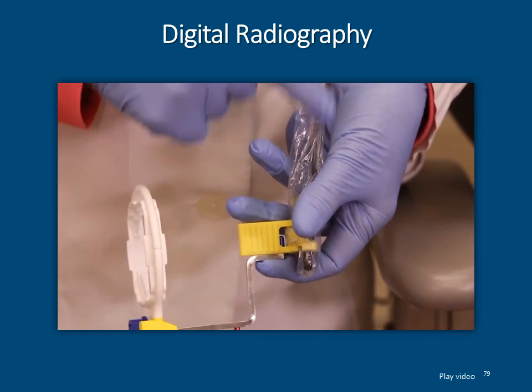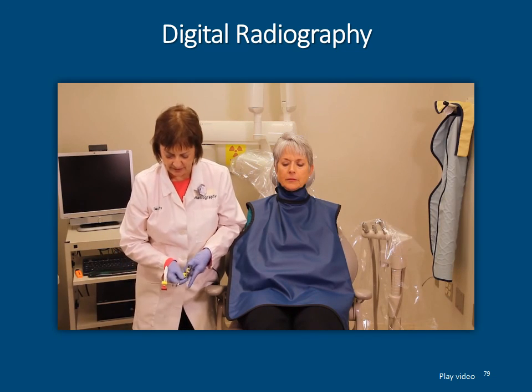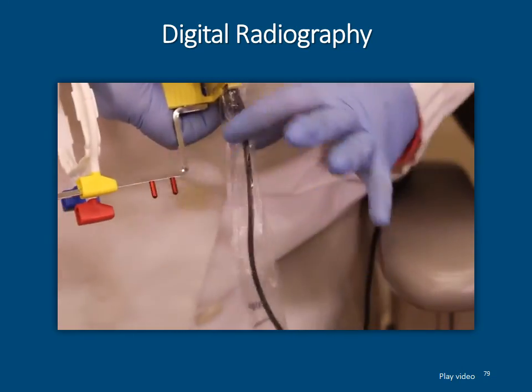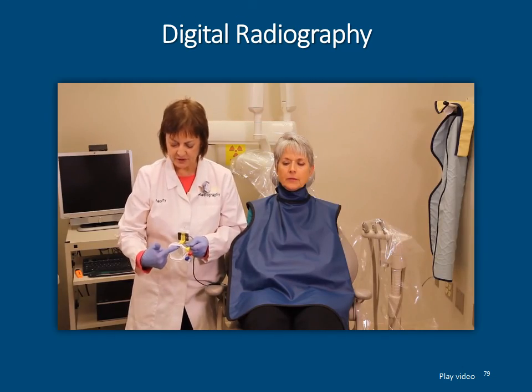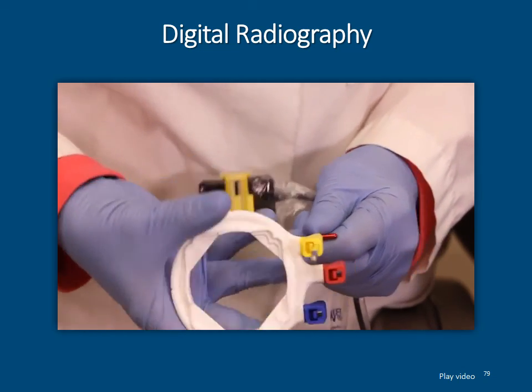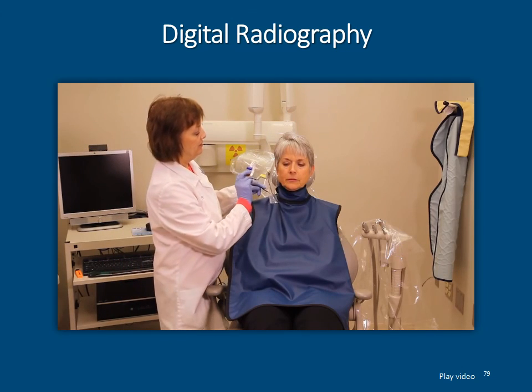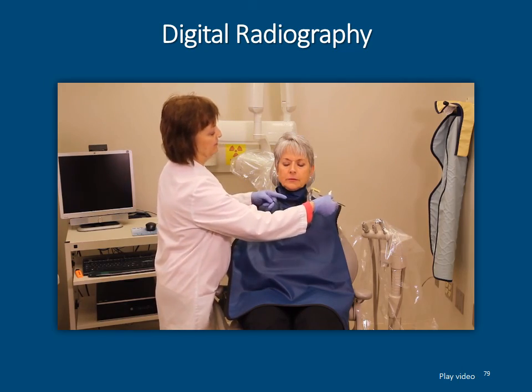Also, you notice my wire is coming up in this direction, bar that way. So again, you're going to just slide this off and turn that also. So now you can see the wire bar. Last thing you have to do, though, is make sure that the sensor is actually positioned right in the middle, and it is not. So last thing, and now you're good to go. Now you're ready to go to do the upper right and the lower left.